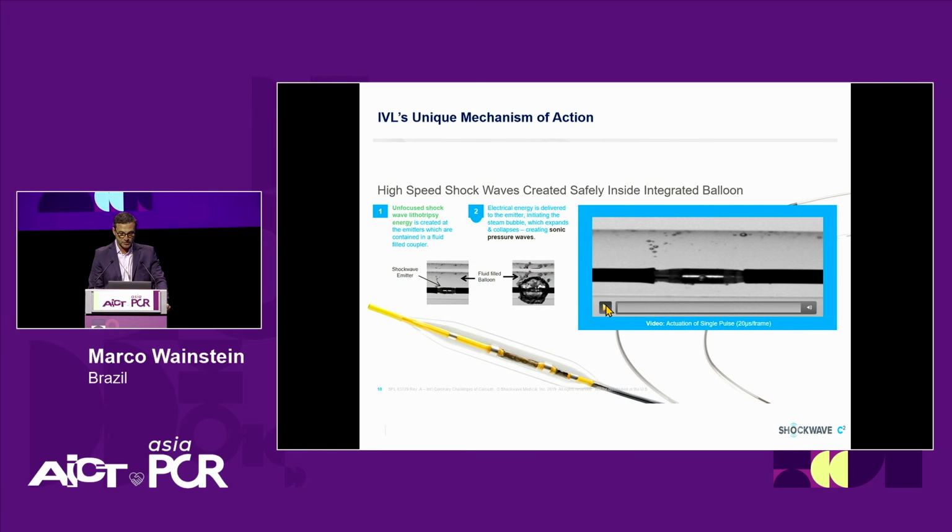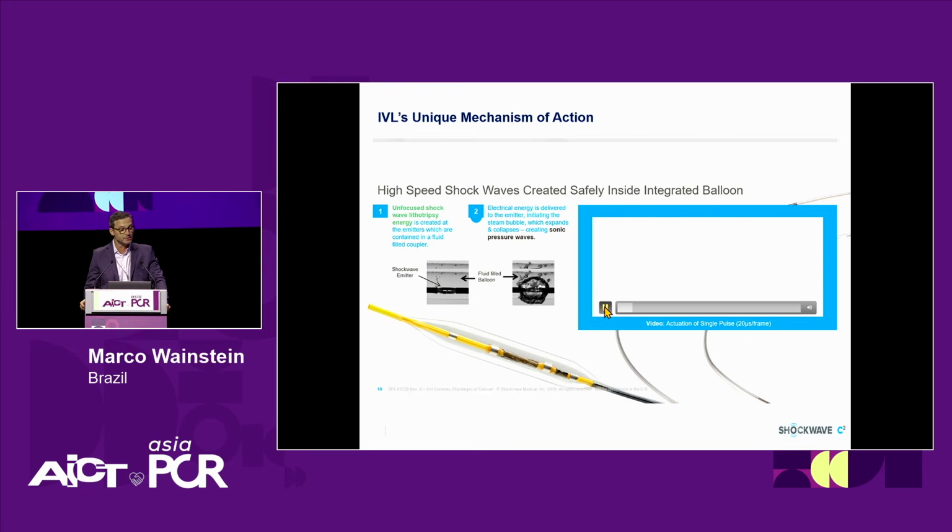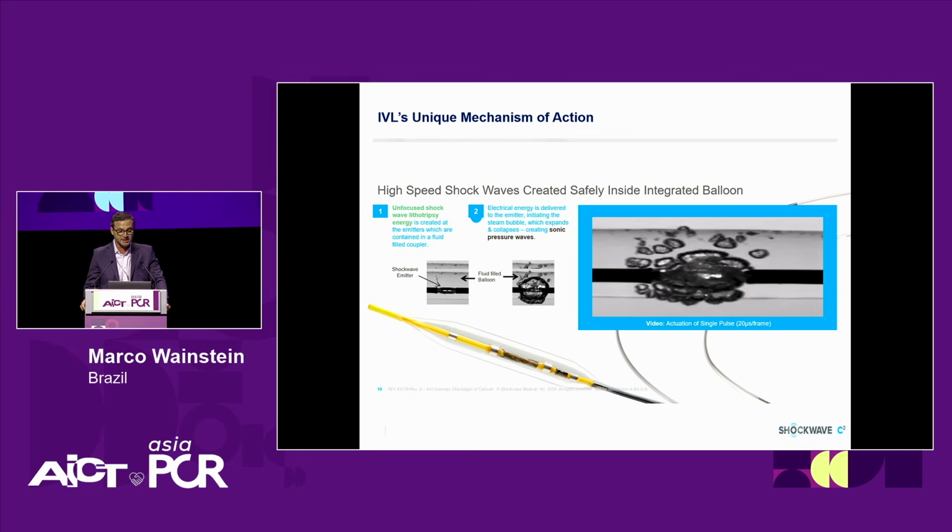And here you see another animation showing that the high-speed shock waves are created safely inside the integrated balloon, and there is unfocused shock wave energy. Then this electrical energy is delivered to the emitter, initiating the steam bubble, which expands and collapses, creating sonic pressure waves.